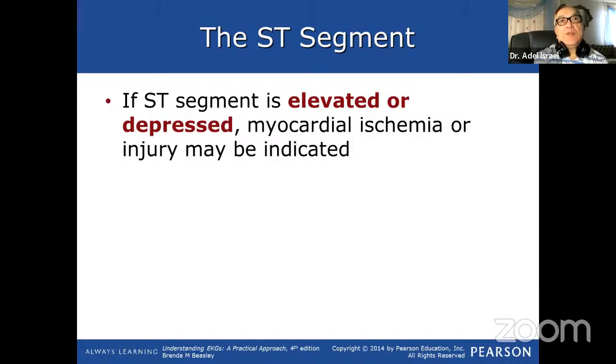If the ST segment, as you see here, is elevated or depressed, myocardial ischemia or injury may be indicated.